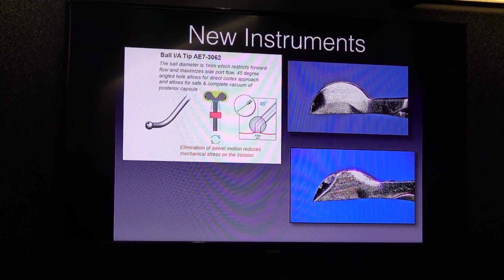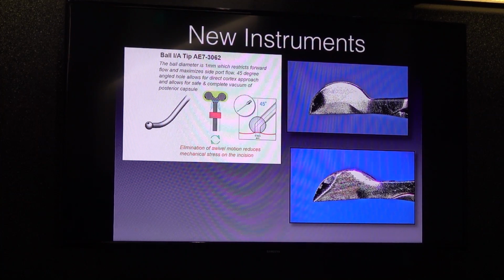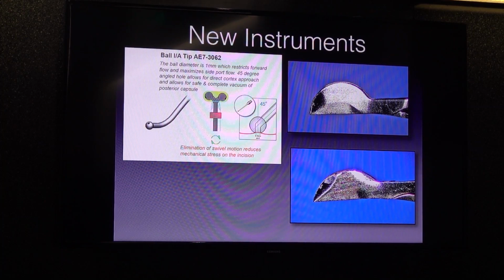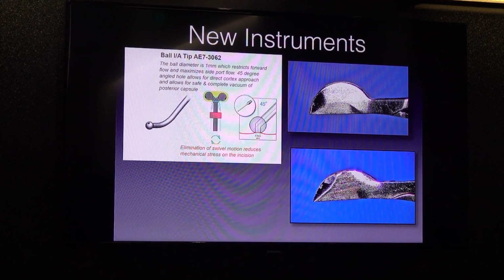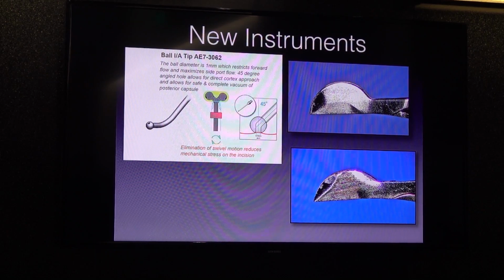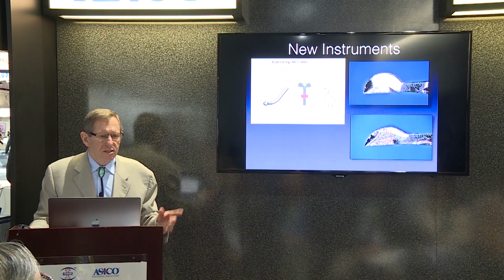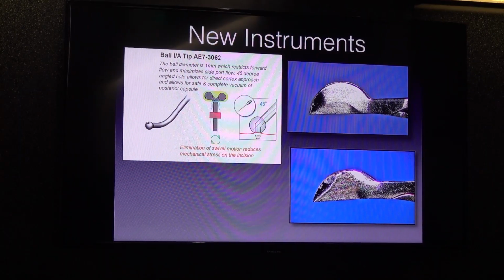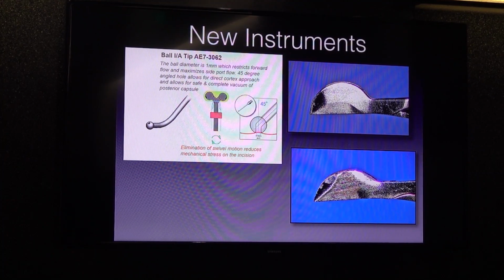But the new ball tip. One of the things that's always difficult for my residents is subincisional, and also to understand that they really want to be at the top of the rhexis, not at the bottom of the rhexis. When they go, they tend to want to slide across the posterior capsule, grab the cortex, and bring it to the center. And that's not very efficient, and it's not safe on the eye. So what this does is it's ergonomically set up so it makes that a very, very simple maneuver. So I think it's worth looking at for sure.